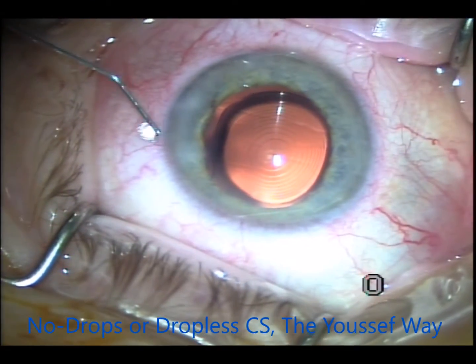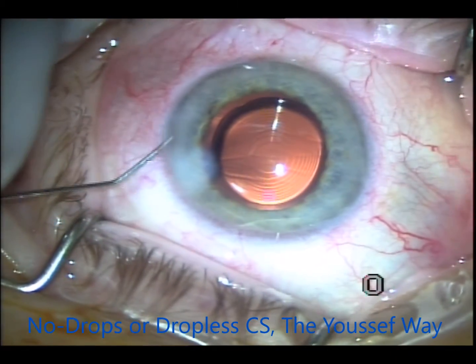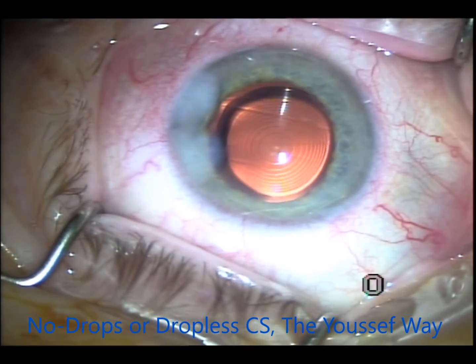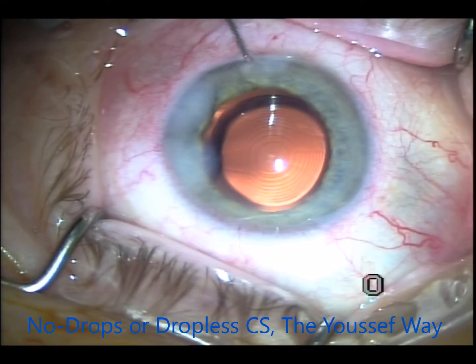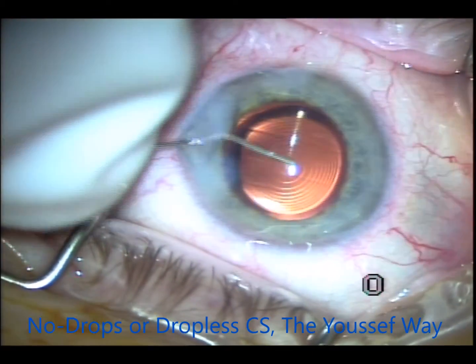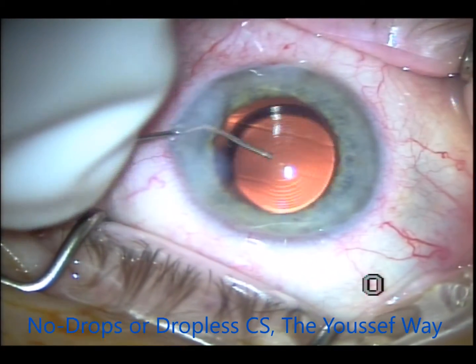This was the first case. I'll show you another one — it was a bilateral Symphony implant. Again, I hydrate the wound with moxifloxacin on both sides of the main wound and the paracentesis, then inject on the surface, in the bag, into the anterior chamber, and behind the intraocular lens.